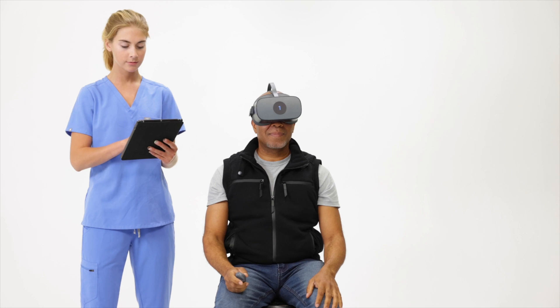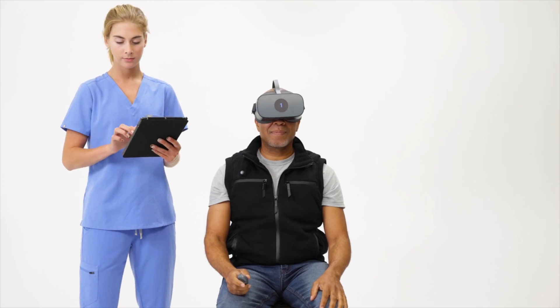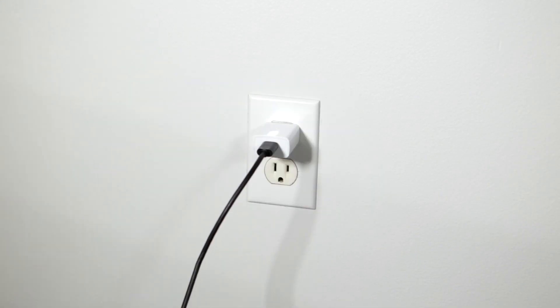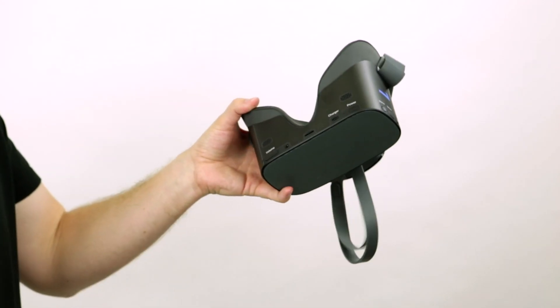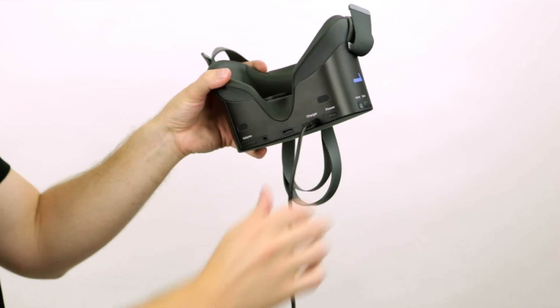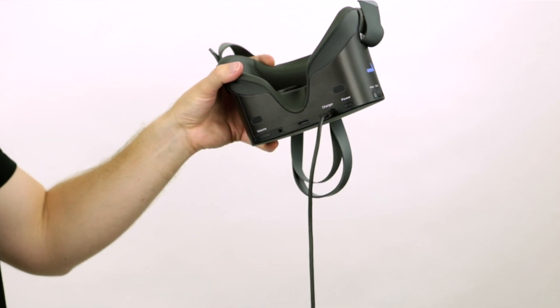With Virtual Field, you can test wirelessly from any room in your office. In order to do this, it's important that you have a protocol in place to keep the device charged. First, make sure your charger is plugged into a wall outlet and not a computer or laptop. Push the charger into the headset until you hear an audible click. If you don't plug the charging cable all the way into the device, it might charge too slowly or not at all.